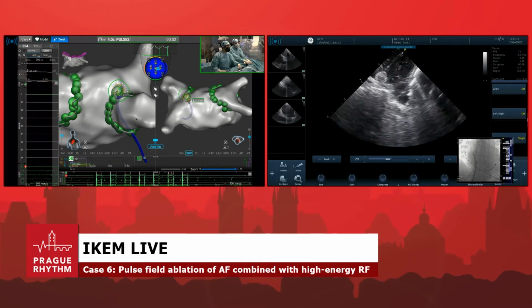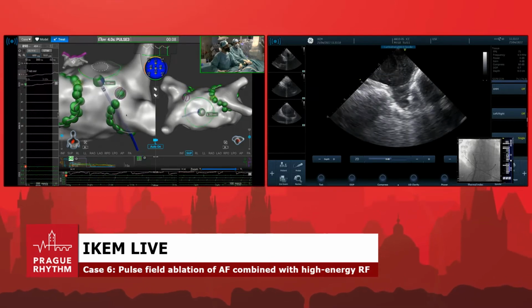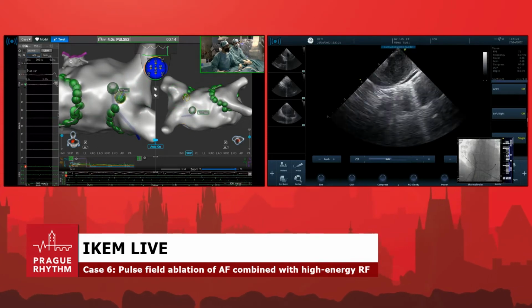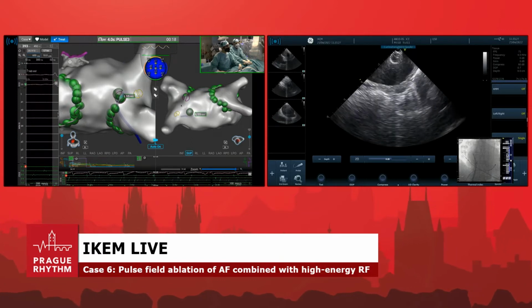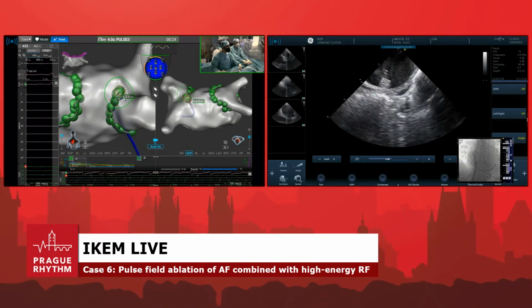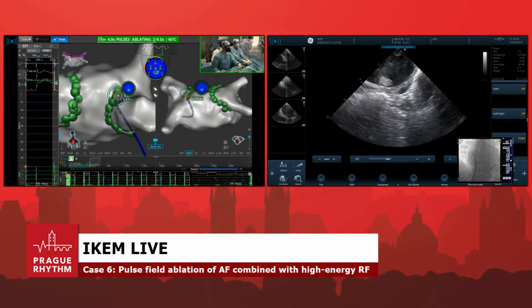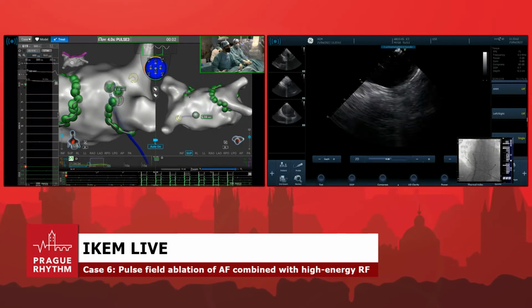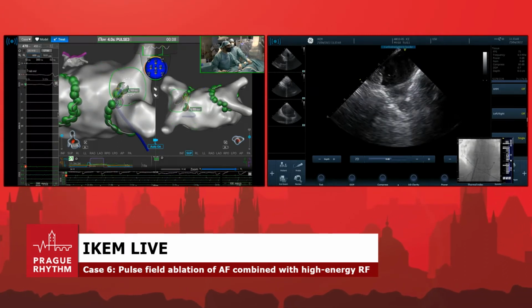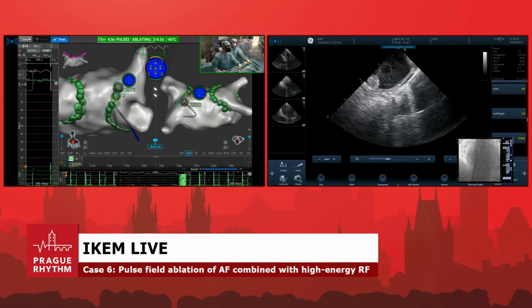So on our, let me just do another lesion. Actually, I think that's okay. Let's just go higher a little bit. Maybe we have a little bit of a gap somewhere there. This side is no potential, but the anatomical gap ablating. So not the electrogram guided, just connecting ablation tags. The green ablation tag is like 7 millimeters in diameter. The large electrode is 9 millimeters in diameter.